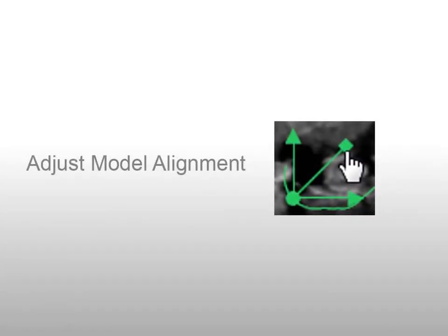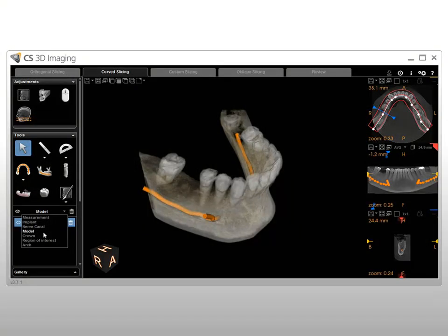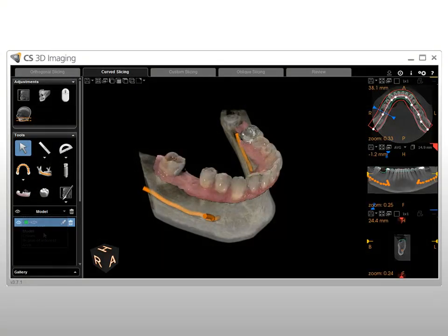You can manually adjust the automatic alignment of a model with the patient volume to refine the result based on careful analysis of the anatomical details. The virtual tools in CS3D imaging software are intended to enhance and simplify implant-supported restoration; however, no algorithm can replace the dental practitioner's experience and skill. To manually adjust the automatic alignment, in the Curve Slicing tab Tools panel, select a model from the drop-down list.